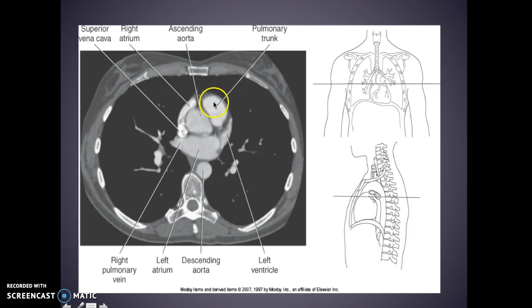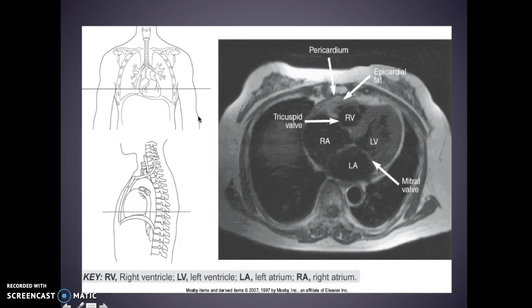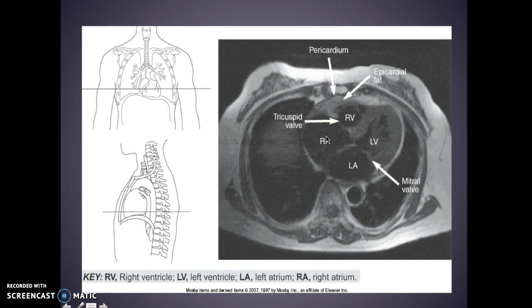Here we're talking about your ascending aorta with your pulmonary trunk, your left ventricle and your left atrium, your descending aorta. The superior vena cava is going to be bright — you can see there it's bright. Your right atrium is right beside your ascending aorta. So here's your pericardium, your epicardial fat, right ventricle, left ventricle, left atrium, right atrium.